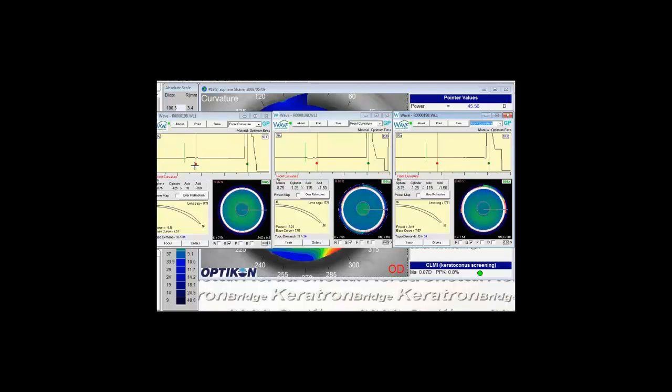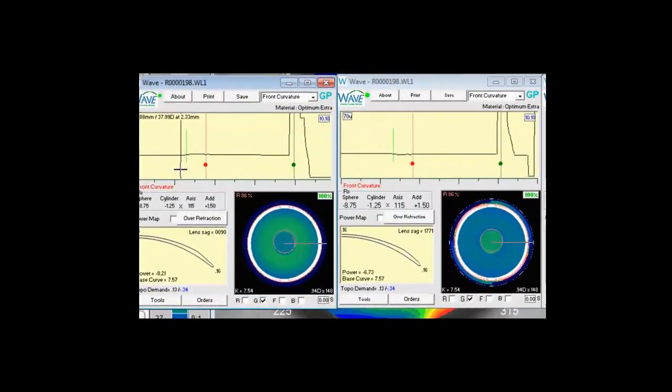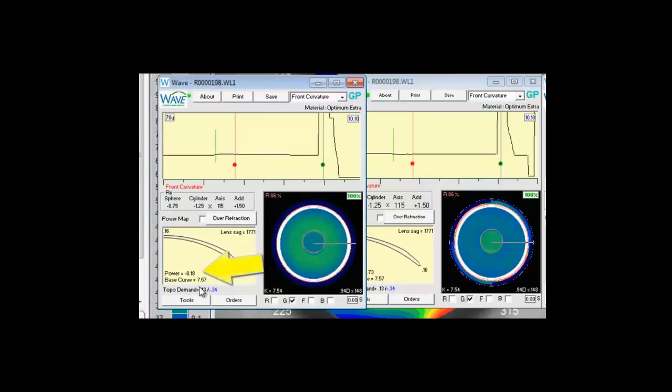So what we'll see here the center distance we have our distance zone is in the center. On this front curvature view as this line starts to increase up take a look at the power of a minus 818 centrally or 820. As we get to that bump the add power or the distance power starts to decrease.